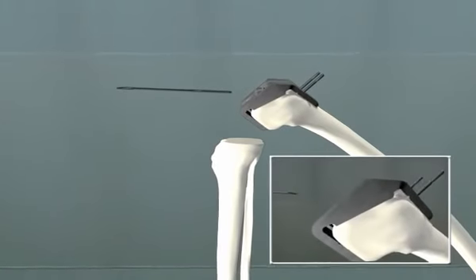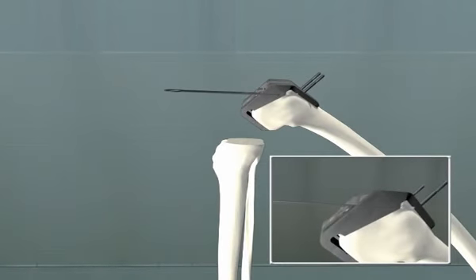The anterior chamfer cut and the posterior chamfer cuts then can be made also with a power saw through their respective slots.